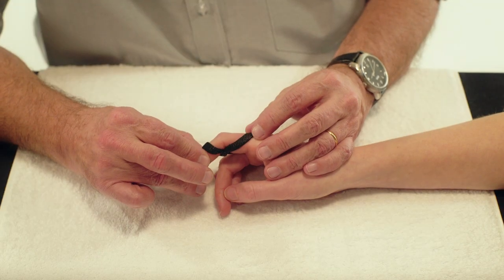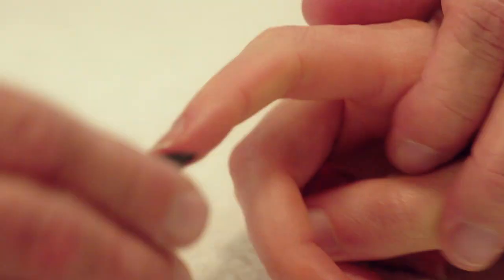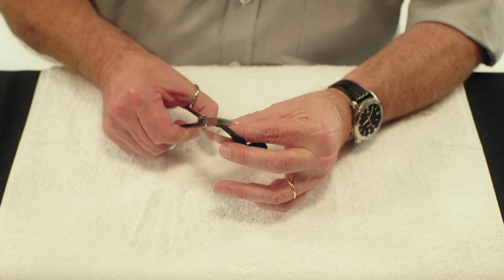Let the Orphicast harden while the finger remains in flexion. Remove the orthosis from the finger and smooth all sharp edges as they harden.